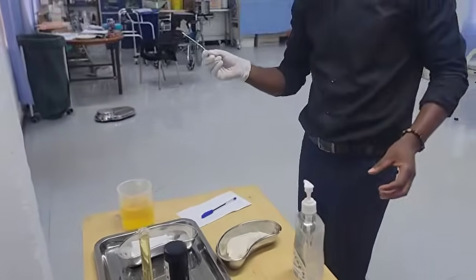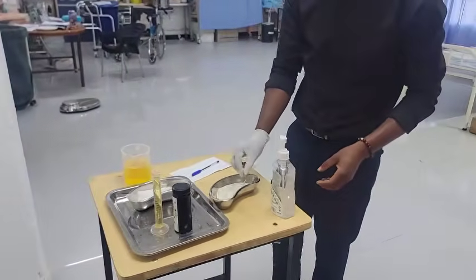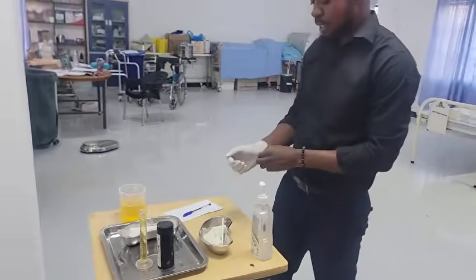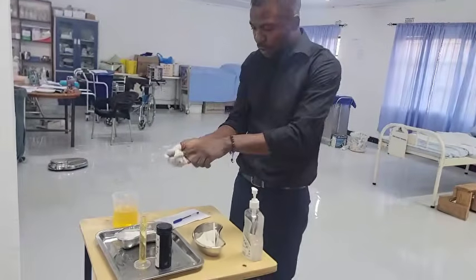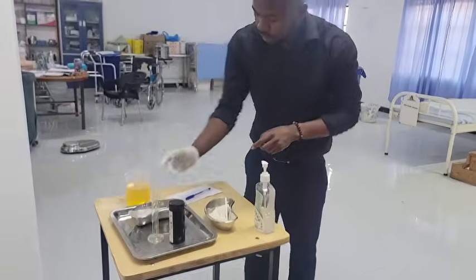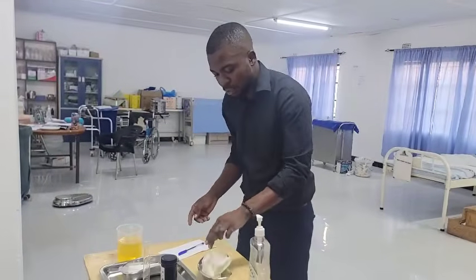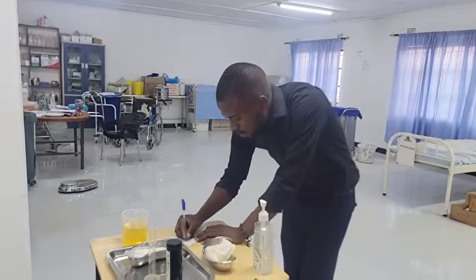So this will go in the bin, or you can simply put it there. As you'll be discarding the gloves, you also discard the strip. Yes. So what you do, you remove this glove. Before you remove, you get this urine, you pour back there, and then you remove this glove and you start documenting. So you start with the physical properties.